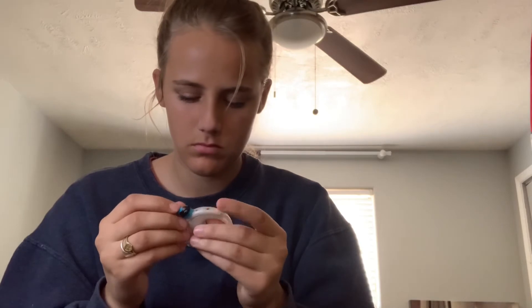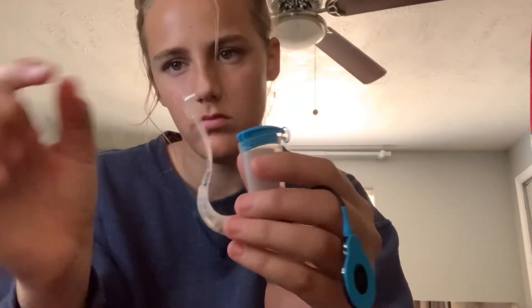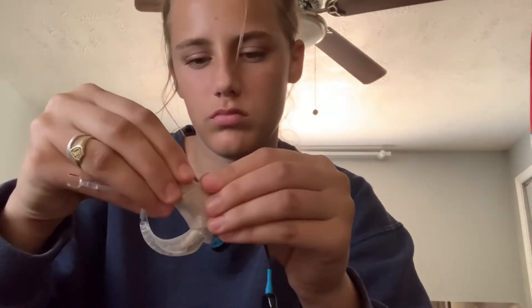That's the finished product. You put it on whatever ear you use — I just have one processor and that's all I need, maybe in the future I'll get another one. There I'm done — look at how cool that looks! Now I can go swimming, that's awesome. It can be kind of a pain to put in and take out, but it's worth it if you want to be in the water and swim with friends or play water polo.